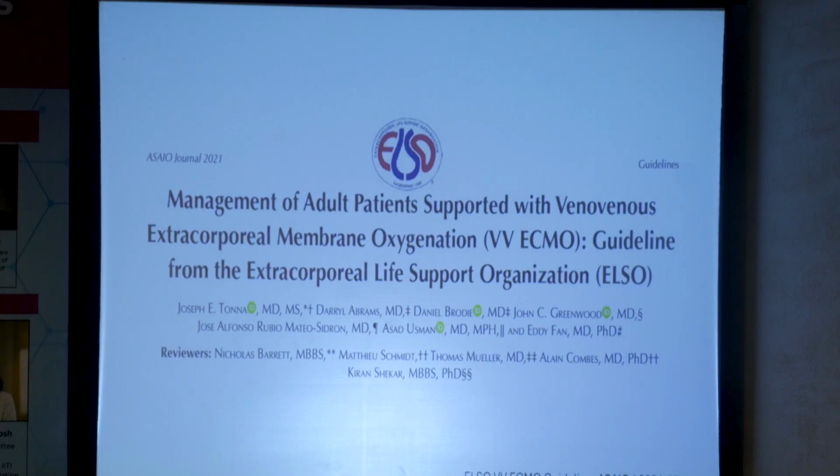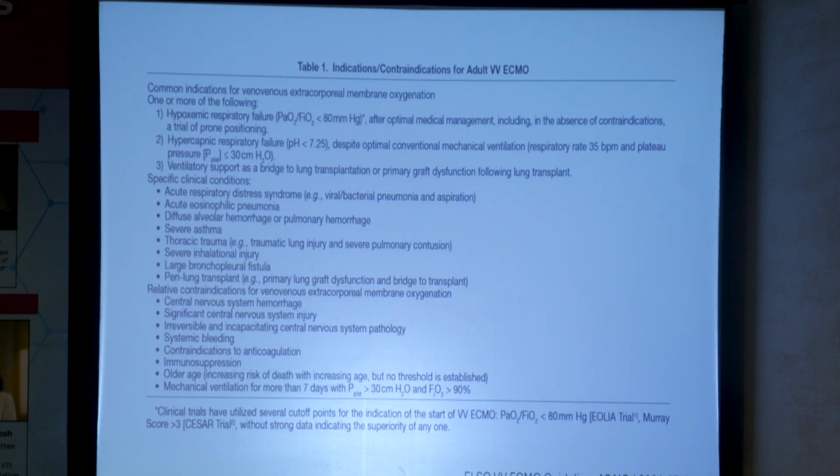Okay, so that's the physiologic basis of why we think ECMO is indicated in certain situations of severe ARDS, severe hypoxemia, injurious ventilator settings. If you want some reference for how we decide who will benefit, the best people to go to are ELSO, because this is the international organization founded by Robert Bartlett that keeps track of all ECMO patients around the world and strategies and outcomes and technology. This guideline was published in 2021. Here is the list of indications and contraindications for ECMO.